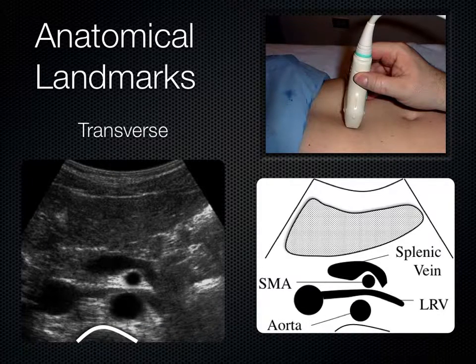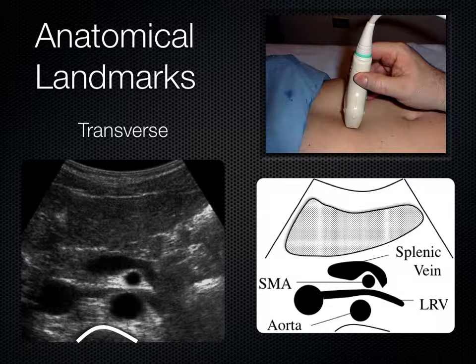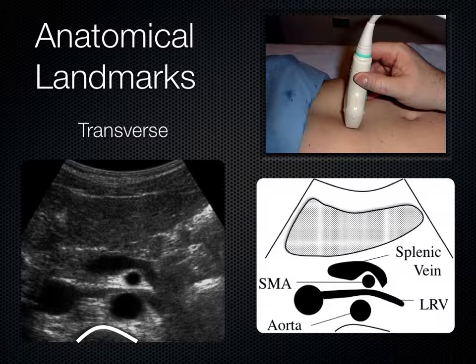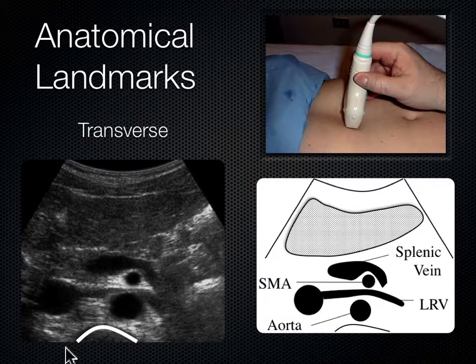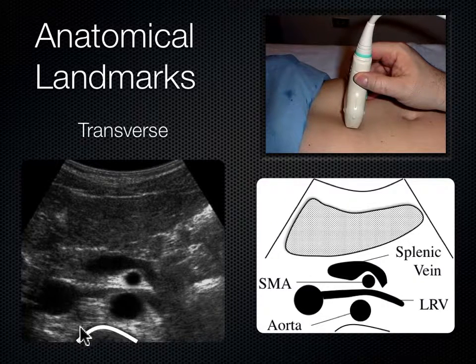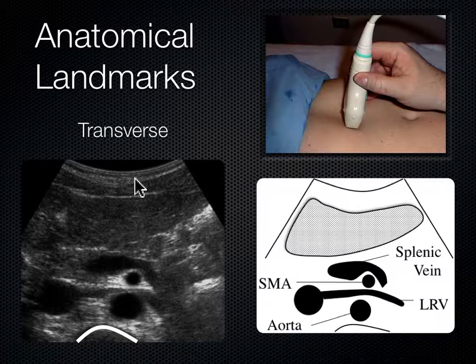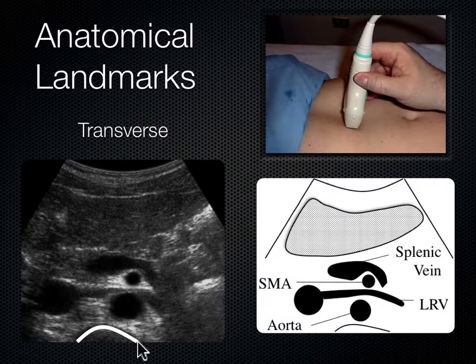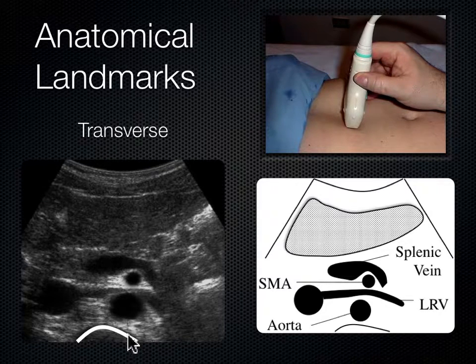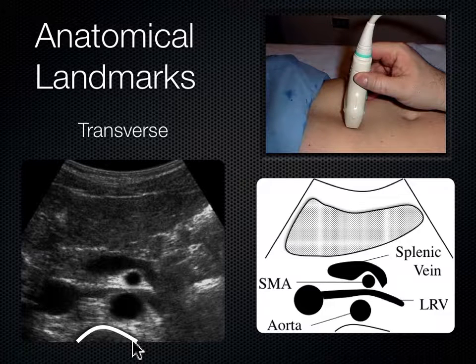Now we're going to turn the probe into a transverse plane. We went from parasagittal—we take the indicator and aim it to the patient's right. Now we're in a transverse plane, getting a cross section of the body. The first thing I look at is the spine shadow, where the sound encounters the spine, can't go any further, and bounces back up towards the probe. Going from posterior to anterior, number one structure is the spine shadow.